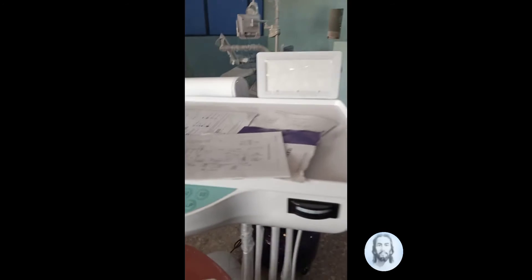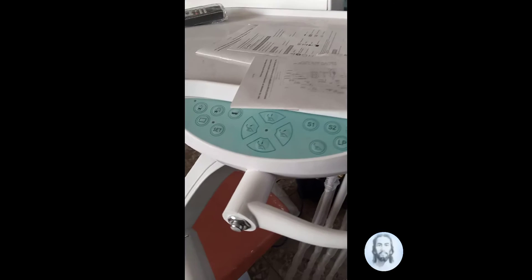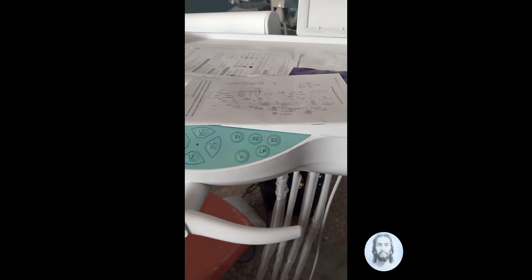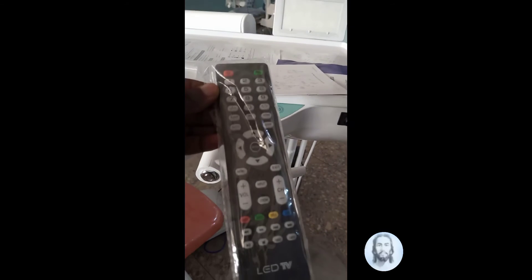Here is the dental tray where various apparatus, tools, equipment, and reagents can be kept. This is the control button for the dental chair, here is the handle, and this is the remote for the monitor.